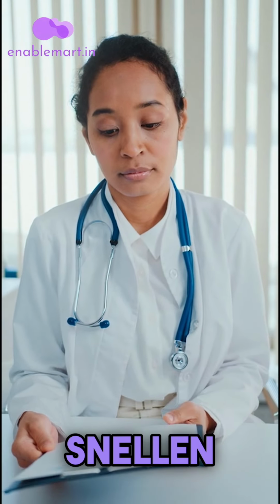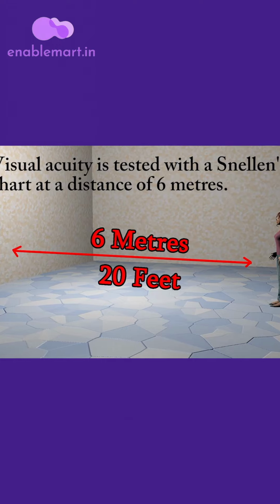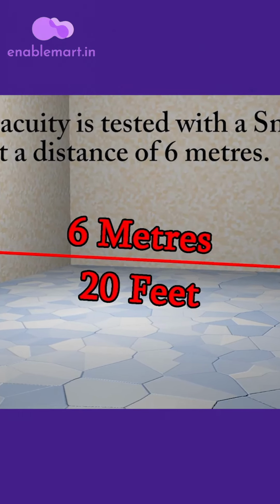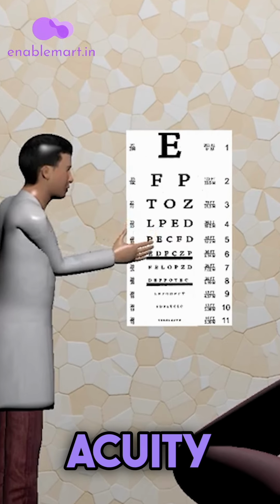To conduct a Snellen chart vision test, stand or sit at the designated distance from the chart. Typically, this distance is 20 feet or 6 meters. Begin reading the letters or symbols from the top row. The smallest row you can read accurately indicates your visual acuity.